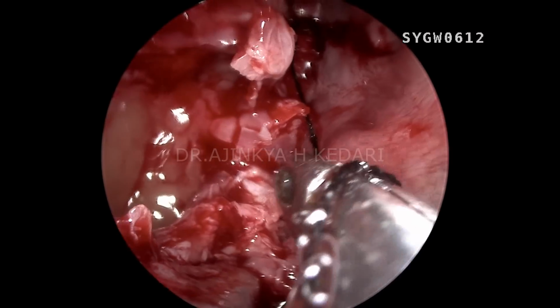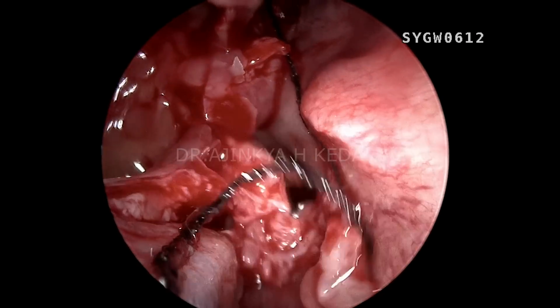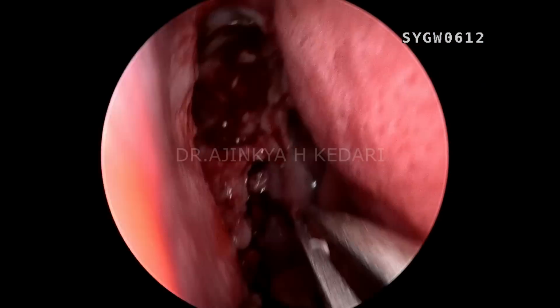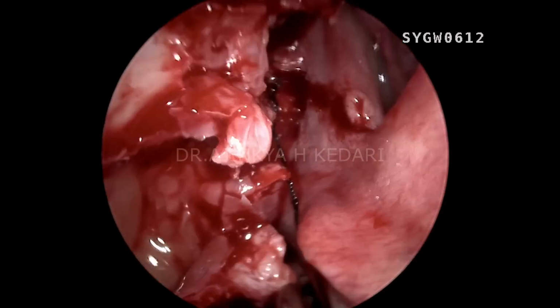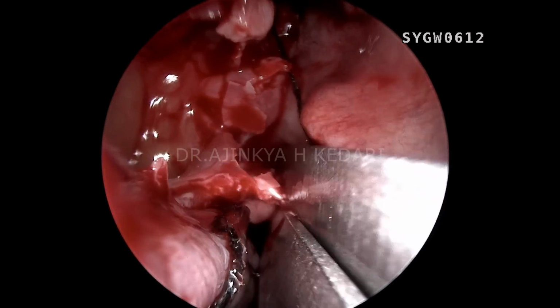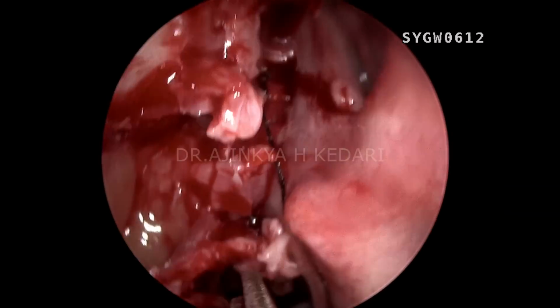Now I'm going to take that middle turbinate out. You can see that's the stump there. Make sure you cut a little ahead, anterior to the stump, so as to avoid any arterial spurt from the middle turbinate artery. So I'll show you how it's done. You just take your turbinectomy scissors, make it horizontal, somewhat vertical, and cut a little anterior to the stump. And then later on, you can cauterize the stump as per your convenience.